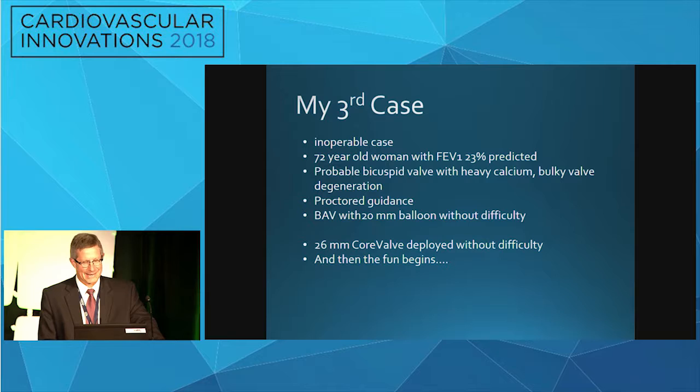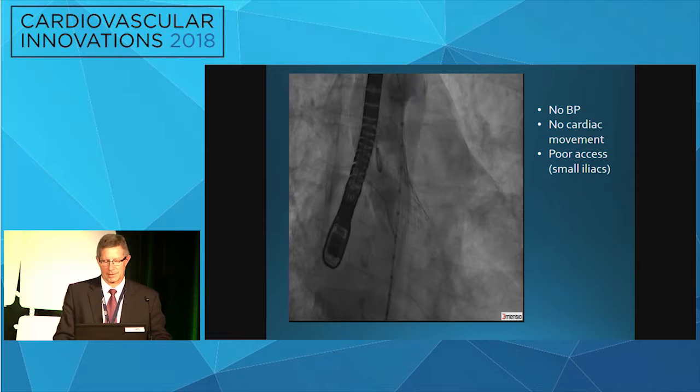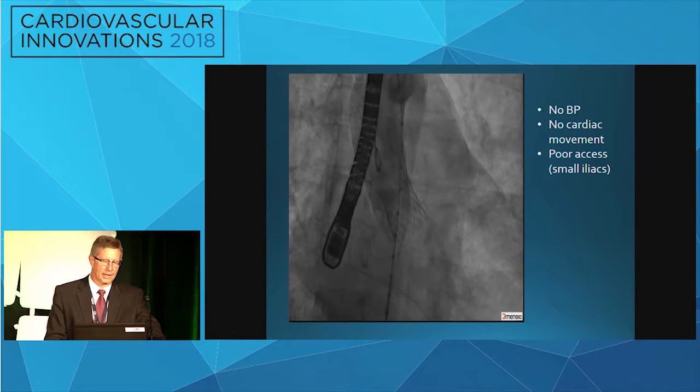And so we did a balloon valvuloplasty with a 20 millimeter balloon without difficulty, and then a 26 CoreValve was deployed, and then all the fun began. She became suddenly hypotensive. There's quickly no cardiac movement noted.